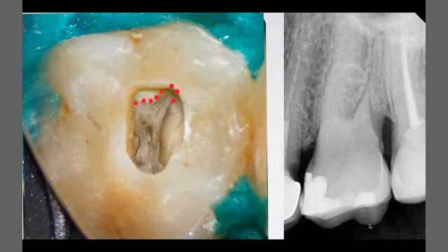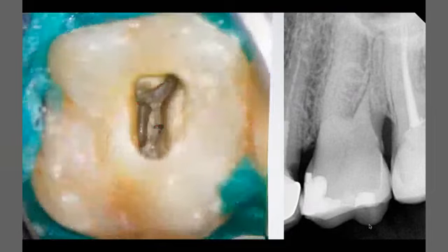So with magnification, in this area, exactly in this area, you can see the bright dentine. With magnification and ultrasonic tips, you have to break up these calcified tissues slowly, dry, re-evaluate, and then go again with the ultrasonic tips.